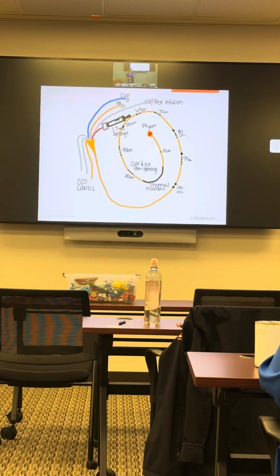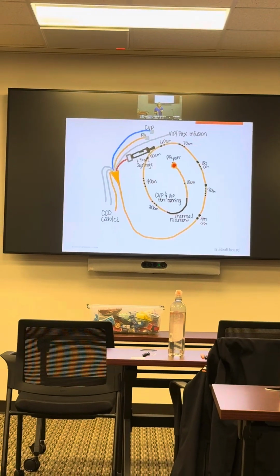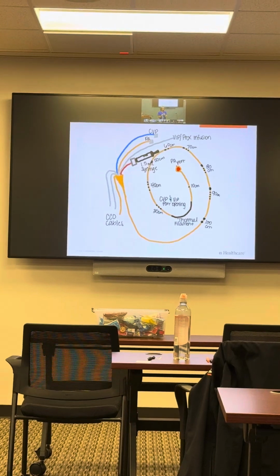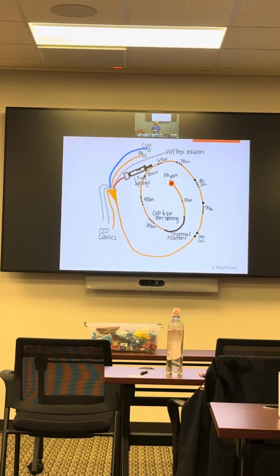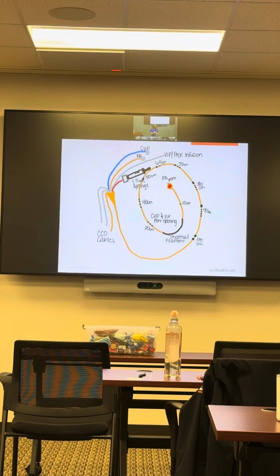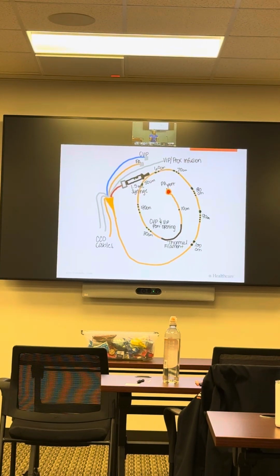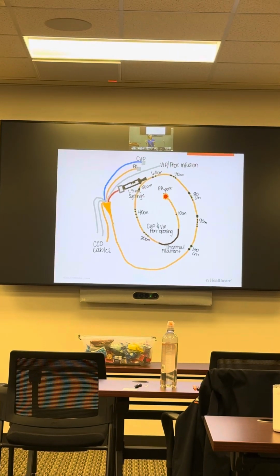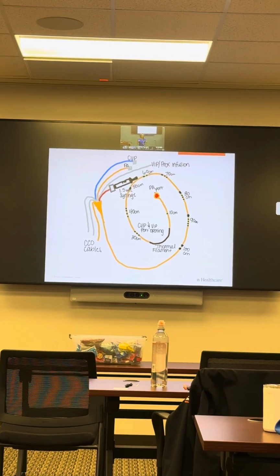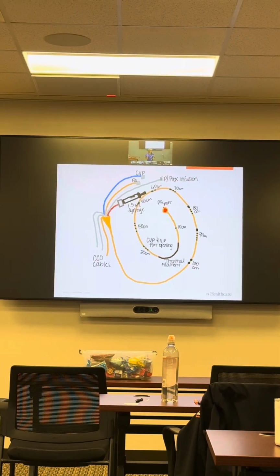So, at its tip, you have a hole. You have a hole and a sensor. That hole, as this is a pulmonary artery catheter, is sitting in the pulmonary artery. That hole, that lumen, will be attached to the yellow lumen. Well, that's handy because on your monitor, your PA pressures are yellow. This is going into the PA, and so it's yellow, okay?